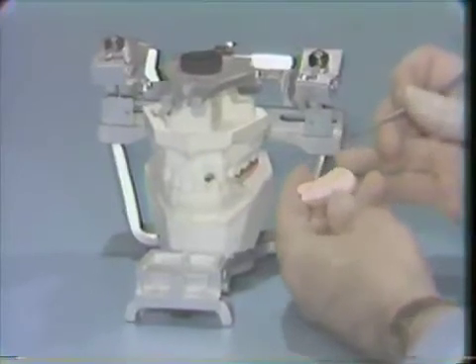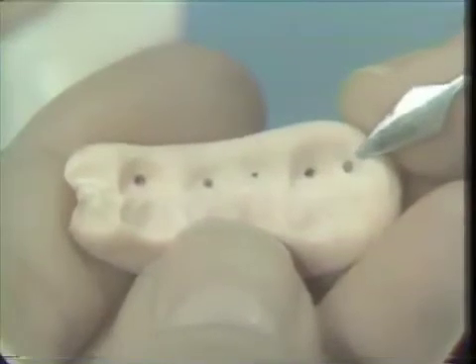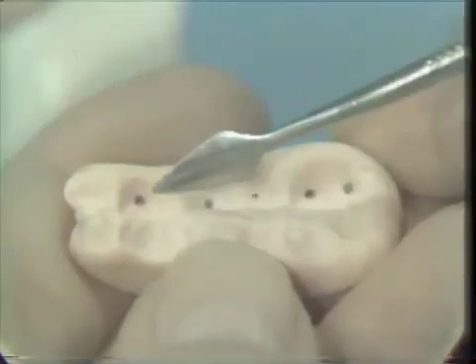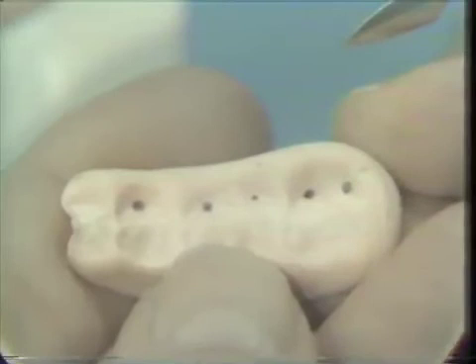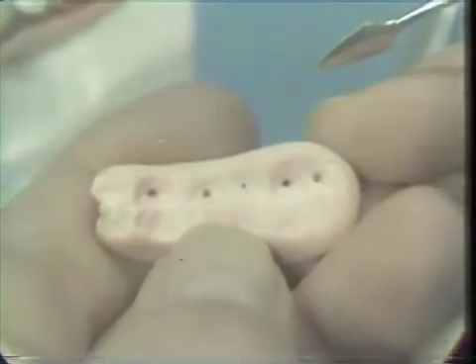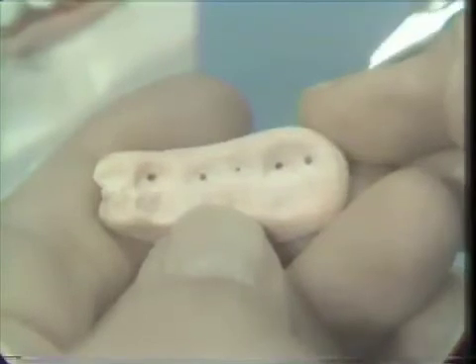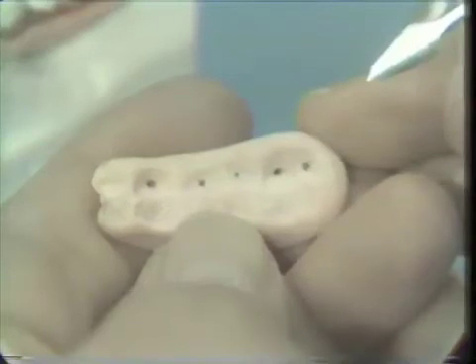You will recall we stated for the indirect technique that it was important that we maintain the stop areas generated by the lingual cusps of the maxillary teeth. The reason for this is when we take the functionally generated wax platform out of the patient's mouth and transfer to the articulator, it will be necessary to reestablish this relationship between the upper and lower member. And by having these centric stop areas in acrylic, we can close the anatomic cast down into the functionally generated registration without distorting the wax.